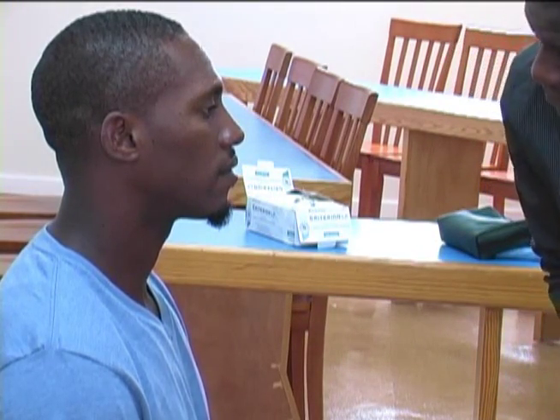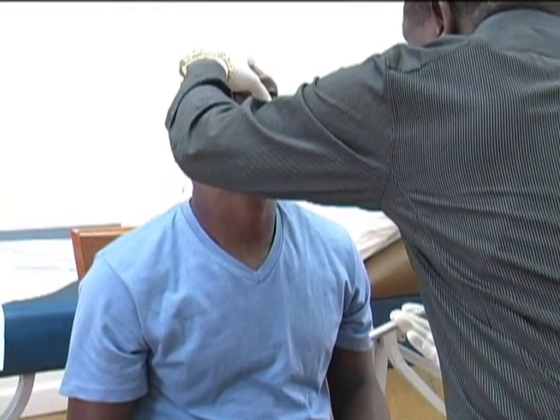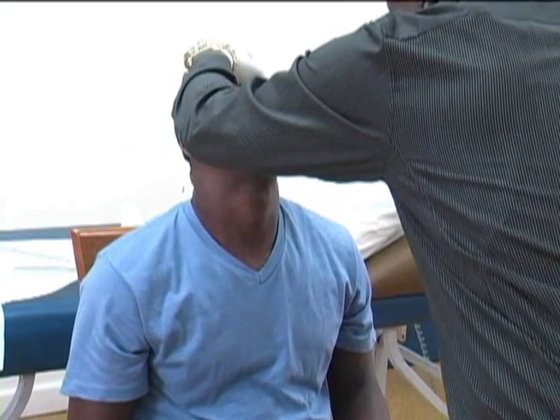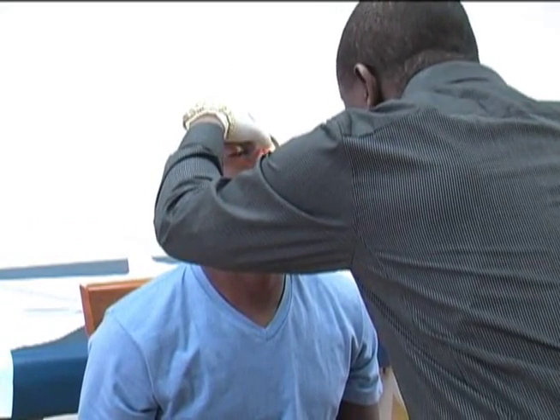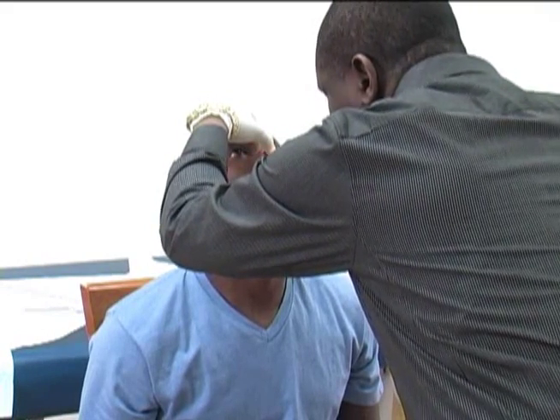Examination of the internal nose or nasal cavity. Examination of the vestibule. The shape should be symmetrical and the septum should be midline. There should be no swellings, excoriations, or discharge. Have the patient bend his or her head backwards slightly. Using the left hand, elevate the tip of the nose with the thumb, the remaining fingers being placed in the scalp near the hairline for counter pressure. Using a pen light, observe for deviation of the septum, foreign body, swellings, ulcerations, and excoriation.